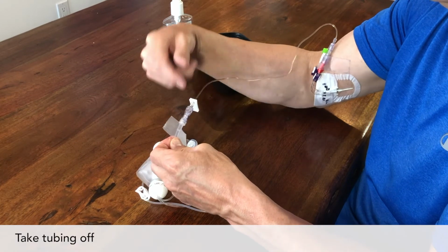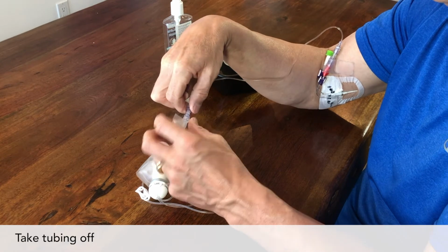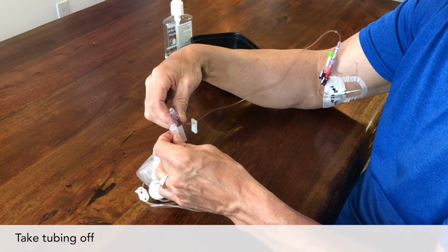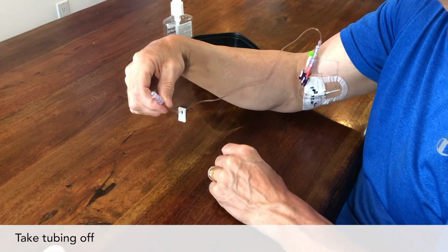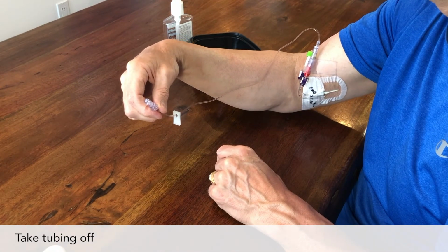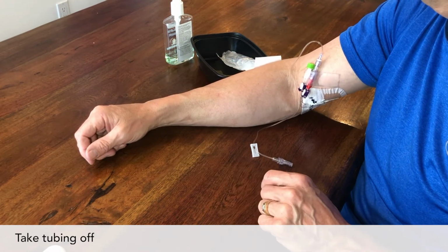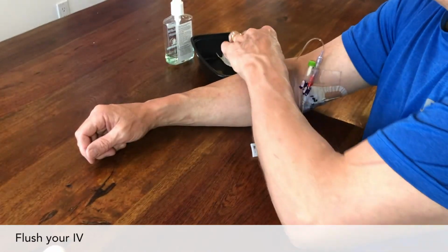Now hold your IV cap. It's important to hold this part to make sure it stays on your IV or PICC. Grab the end of the pump tubing in your other hand and twist the pump tubing off. You need to make sure that you twist the tubing off, not the IV cap. You can set the end of the tubing and the cap down and set the pump aside. Now you need to rinse the medicine out of your IV.